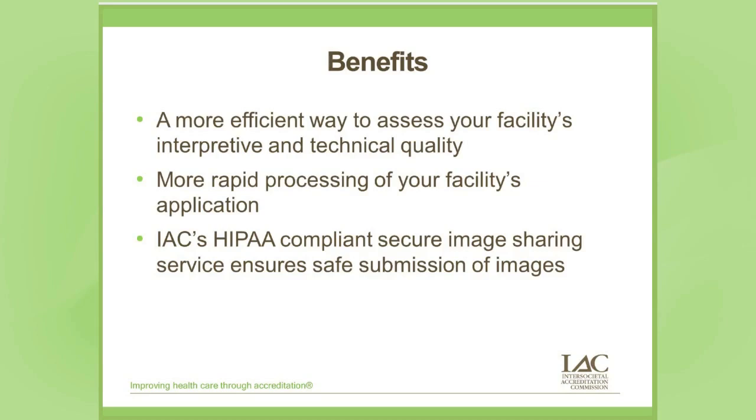I would like to provide the information about the CT, dental CT, and MRI. For the case study images, they do need to be in a DICOM format. Do not submit them in a JPEG or a PDF. They must be in a DICOM. However, for CT, dental CT, and MRI, for the QC phantom images, those can either be in a JPEG or a PDF or in a DICOM. That's the only option that you do have specifically for your QC phantom images.